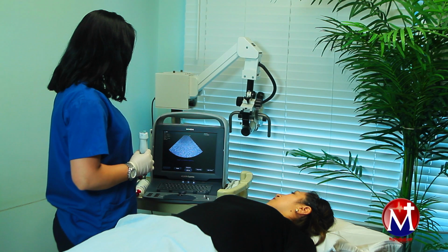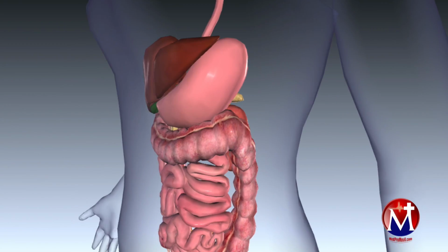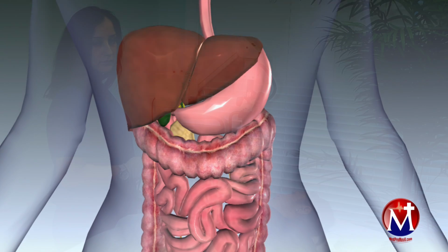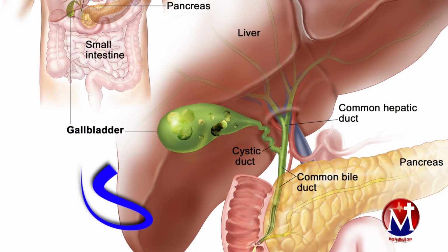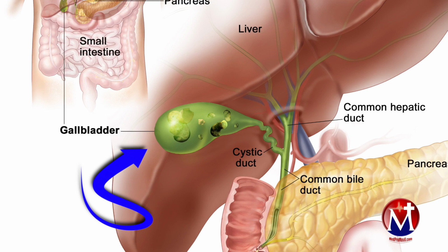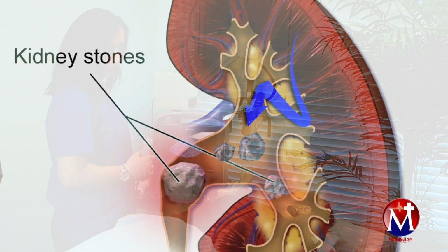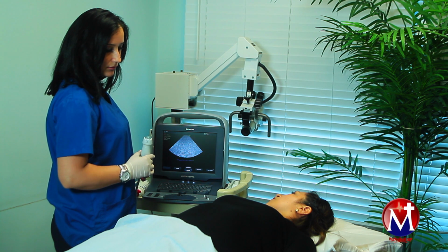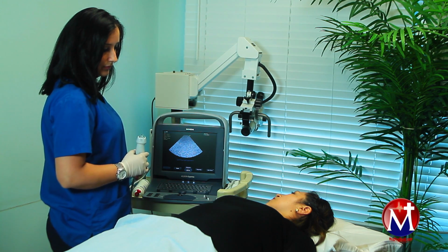The main indications for use of abdominal sonography include abdominal pain, which is the most common indication, abnormal liver function tests that are received from blood work, enlarged abdominal organs felt on palpation during physical exam, possible gallstones or kidney stones, other abnormal lab results that are suggestive for abdominal pathology, or even in an oncologic patient who has a known primary cancer in the search for metastatic disease.